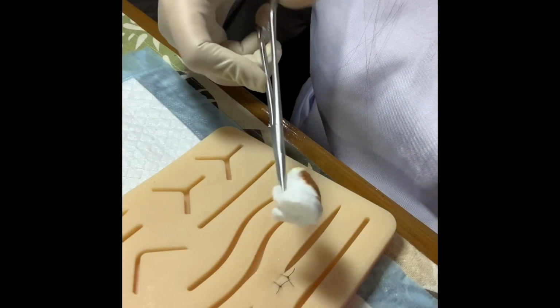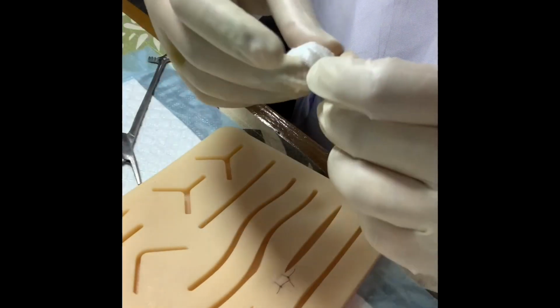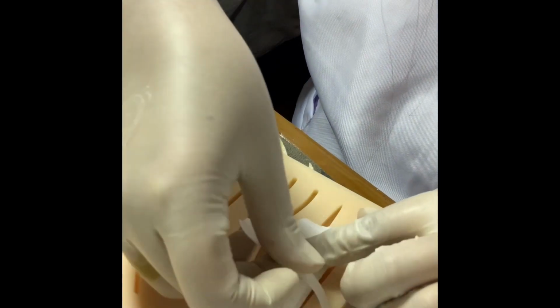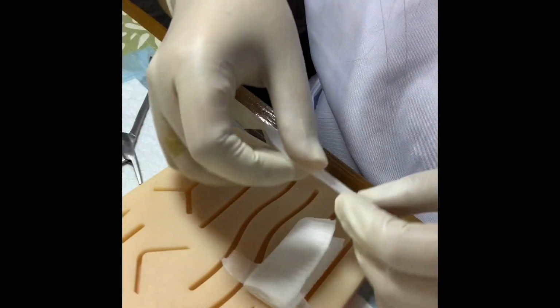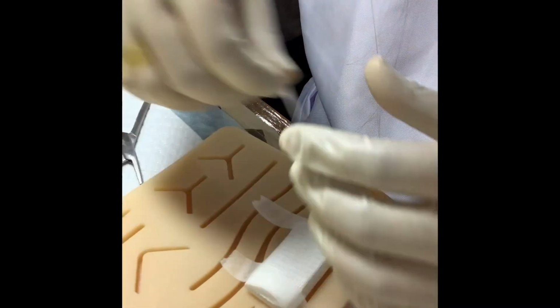Cleanse the suture site with povidone iodine. Apply a small amount of antibacterial ointment and cover with an appropriate size, sterile, non-adherent dressing depending on the nature and extent of the wound. Once you have completed suturing, you must ensure that you account for and dispose of your sharps immediately in a sharps bin.